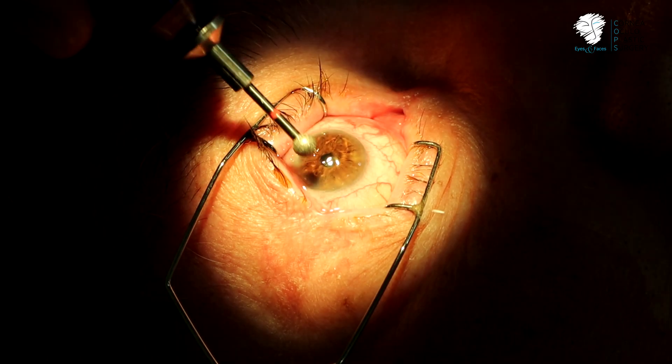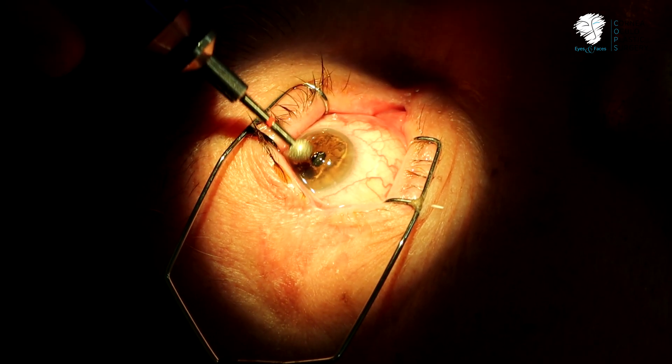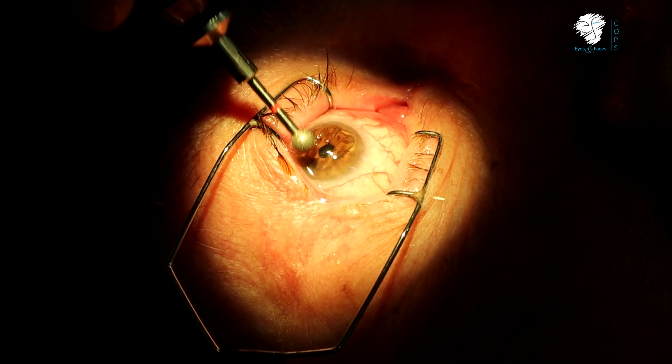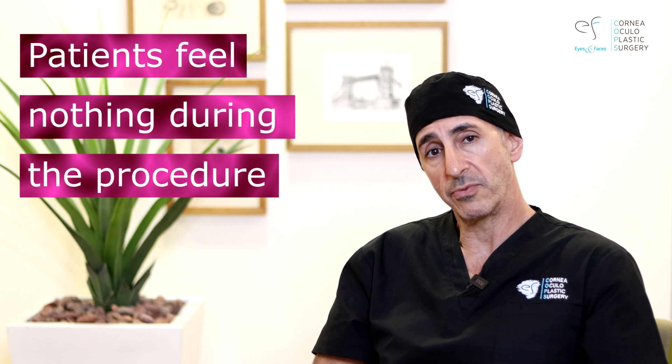You'll see from these videos how I polish the cornea with a burr, running it back and forth across the cornea until I'm satisfied that it's been polished. Once I'm satisfied, I put in a contact lens and the patient goes home with drops. It might look unpleasant, but believe it or not, patients feel nothing. Afterwards, it can be painful though.